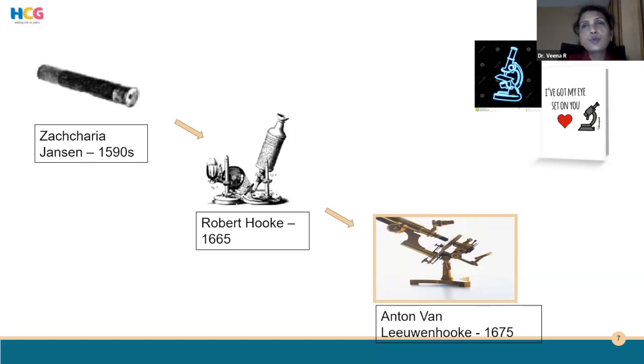And let me tell you, if you're adopting digital pathology, you are not going to let your microscope out of it. Right. It's definitely not a substitute for your microscope. It is going to be a supplement to your microscope. So you should not feel that you are going to misdiagnose. No, that's absolutely not the case.